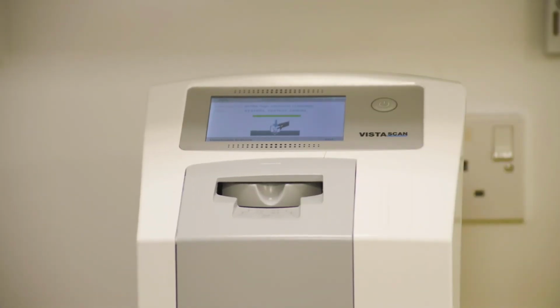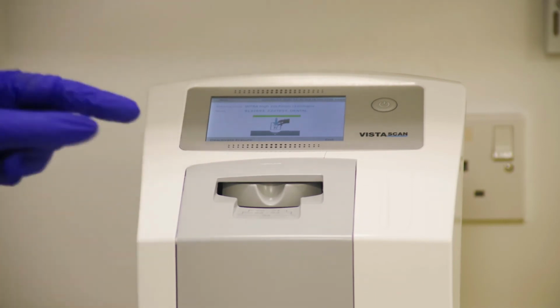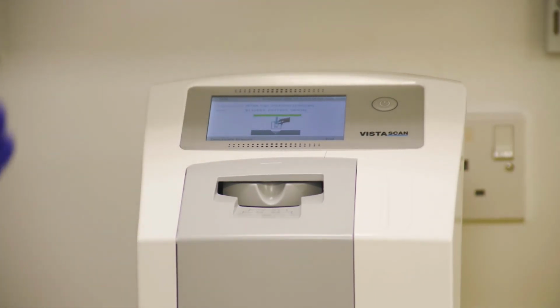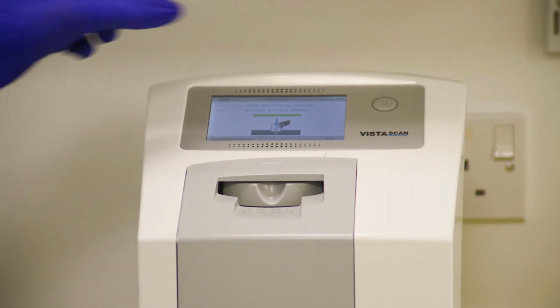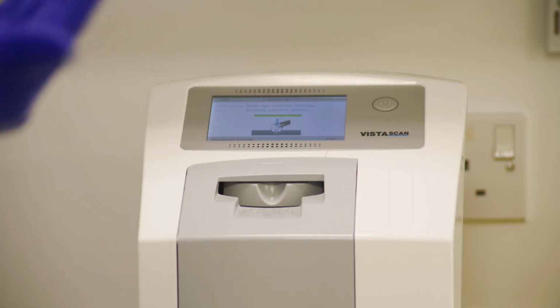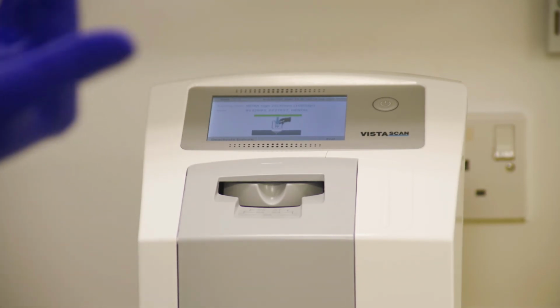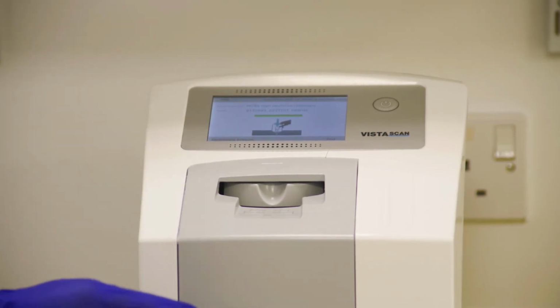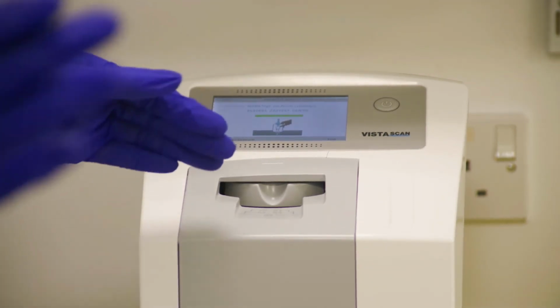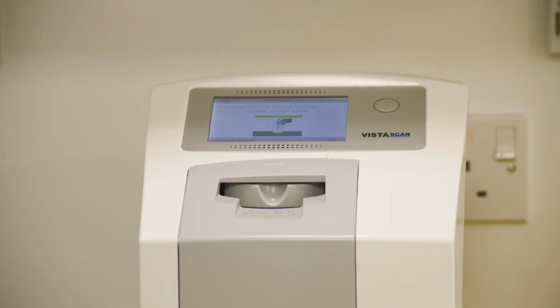Okay, so I don't know if you saw a preview image, but there was a preview image coming on the screen. Just to remind you that if you don't see any preview image, it could possibly mean that you have scanned your phosphor plate the wrong way around. So once it comes out, quickly grab it so that you don't expose it to light and then refeed that into the processing machine.